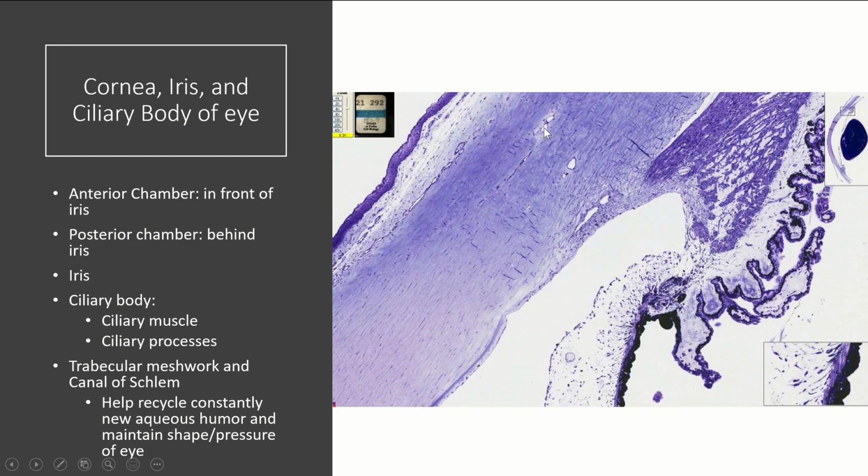And you can see how we've got blood vessels here, right? That's how we know this is in the sclera, because remember we said the cornea is avascular. There's no blood vessels throughout the stroma. The sclera, there are. So this is the sclera up here. And here's where we've got this corner in the eye where the iris meets the rest of the eye. Okay, so that's that kind of junction.